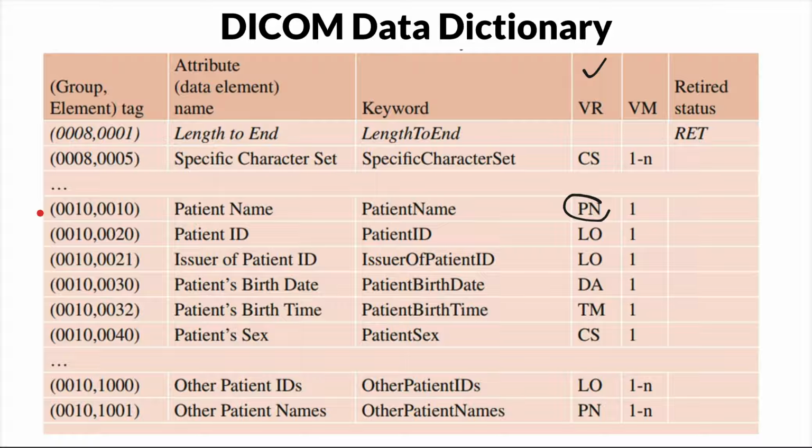Okay, it's different from your ID. It's different from the ID. It's a tag. It's like a database generated in a DICOM, and they try to use this tag for us to be able to group these attributes and features.